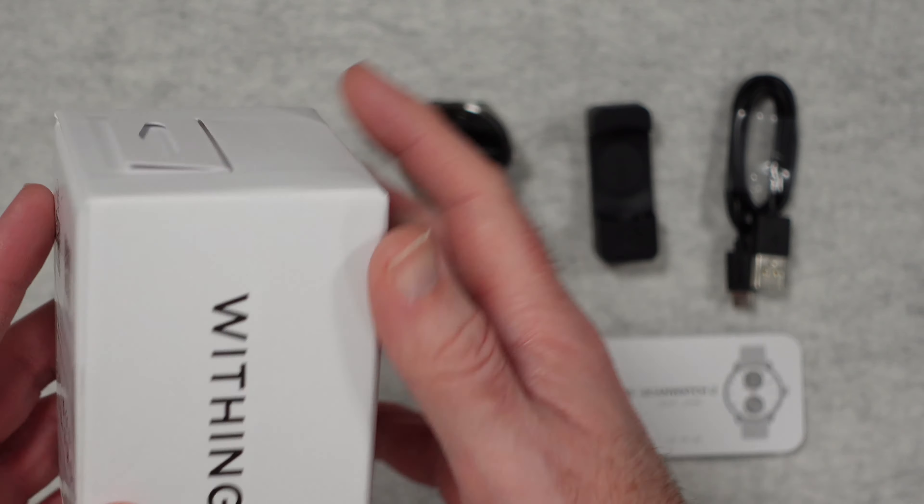The box looks really nice — this is like a very nice presentation box. On the side here we get a look at the app, which will actually track and give you access to the data: things like your heart rate, sleep, also your blood oxygen levels. So many different measurements are tracked within the app.